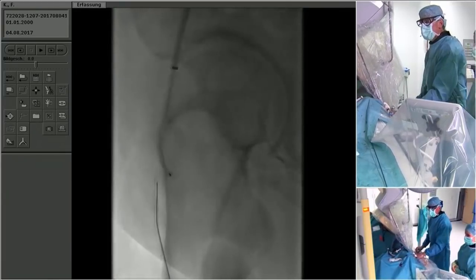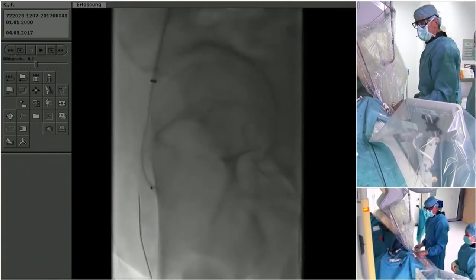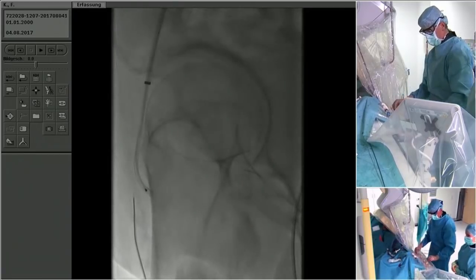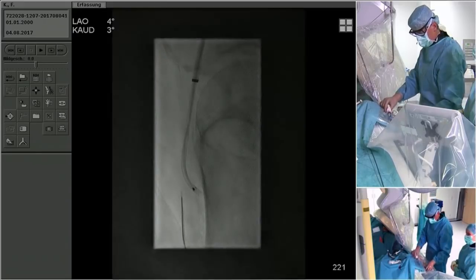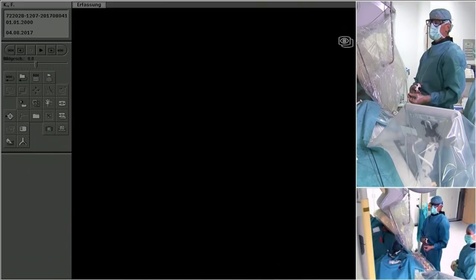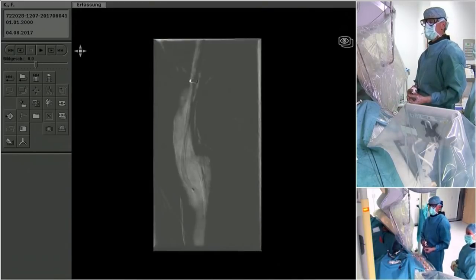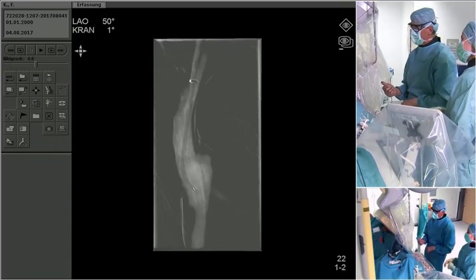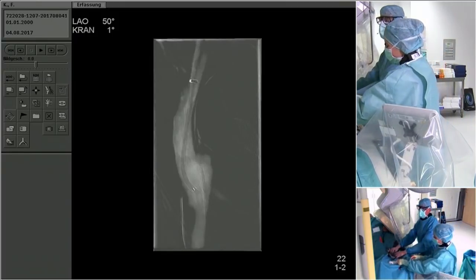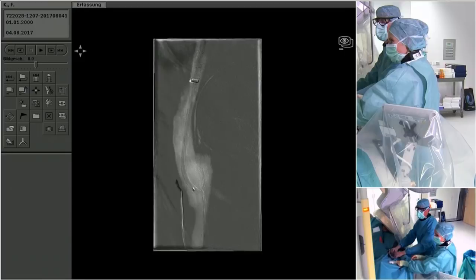Maybe draw, doesn't look too bad. That looks pretty promising actually. Coming close. Now I wish I had a little bit more angle in the needle. So I may do this by leaving the wire here now.